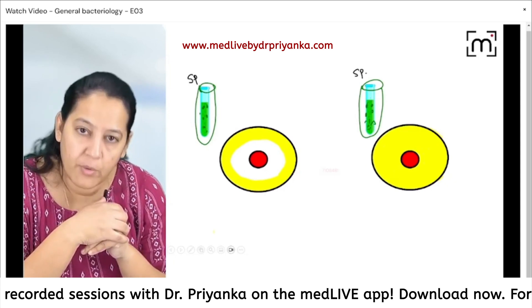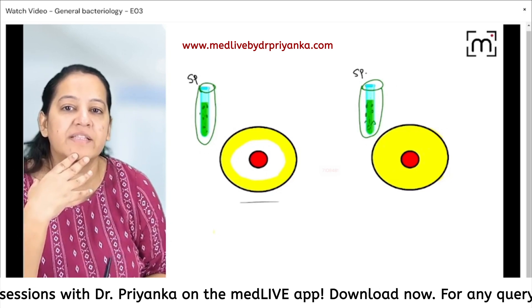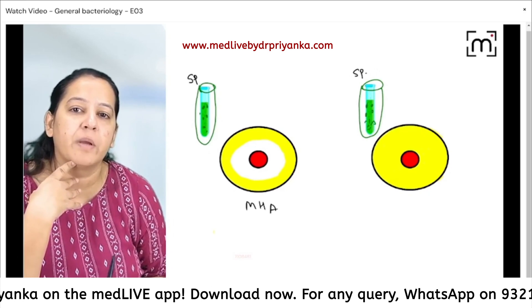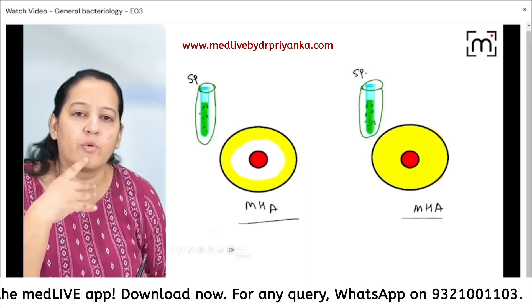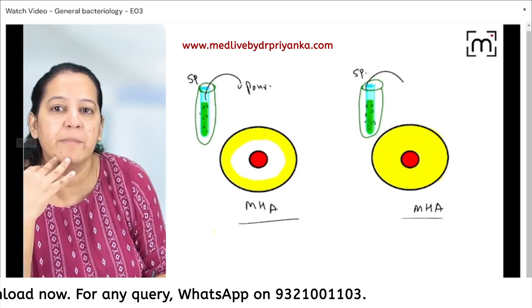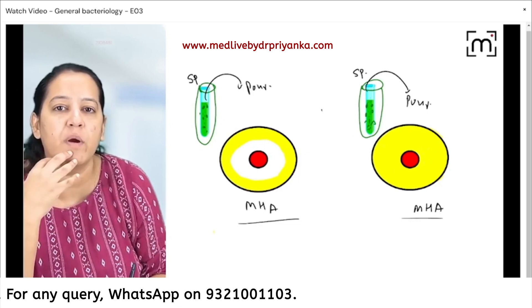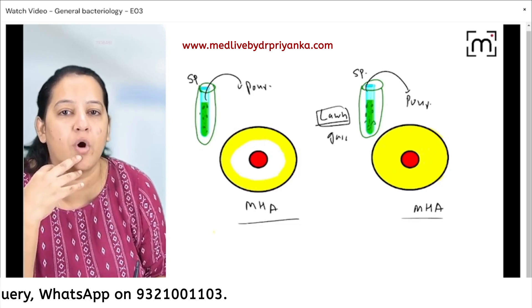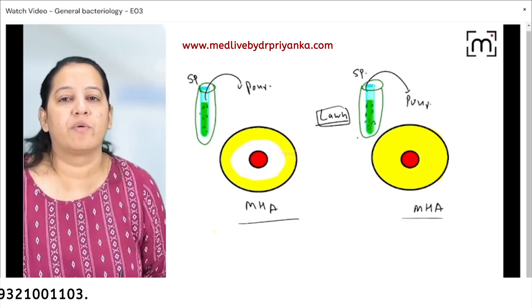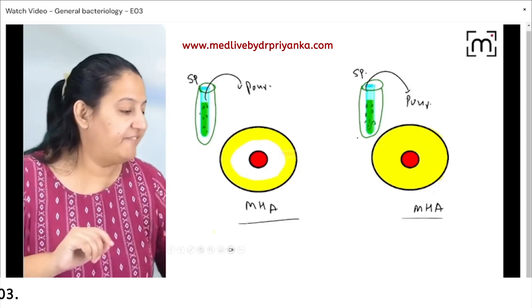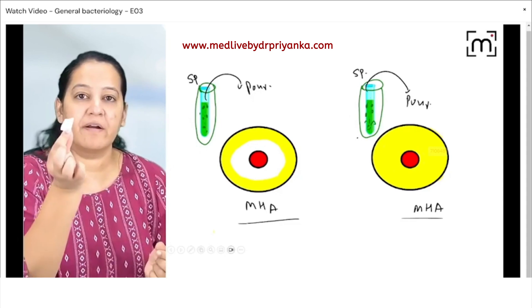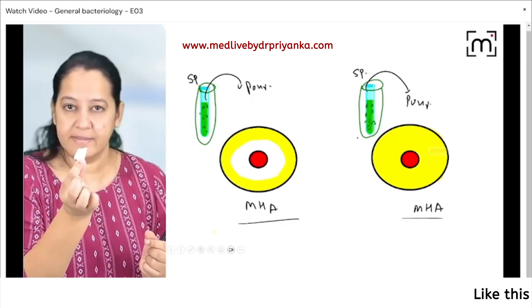I will pour my specimen on the agar and spread it to make a lawn culture. Lawn means like a garden — colonies will be everywhere. Now I will take a filter paper cut in circular fashion. I will dip it in the antibiotic — suppose this is penicillin. I take another filter paper and dip it in cephalosporin. So I have various filter papers dipped in various antibiotics. This filter paper is dipped in the first antibiotic, this one in the second, likewise third and fourth.